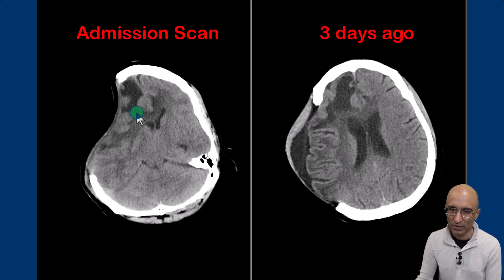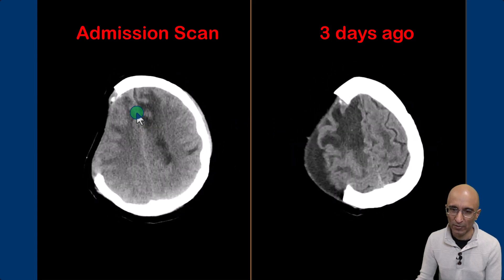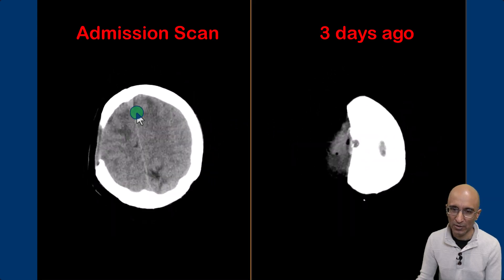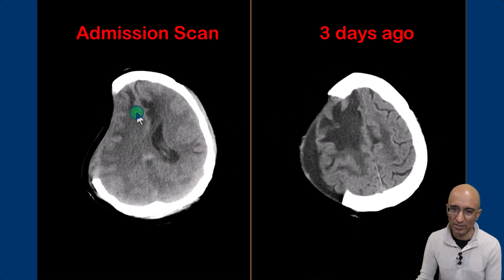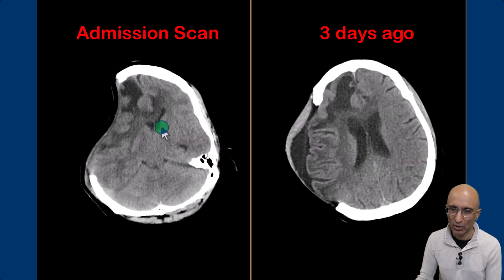The images on the left correspond to the CT which was performed when the patient presented to the emergency department. As you can clearly see, the skin flap is sunken. There is also paradoxical herniation of the brain to the contralateral side, and you can clearly see the subfalcine herniation.